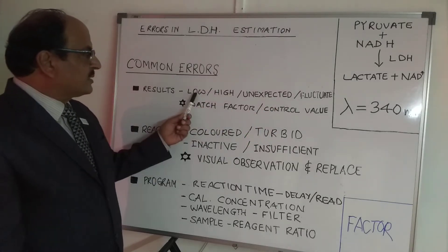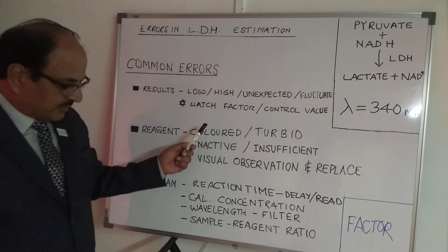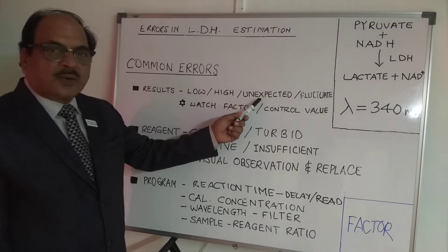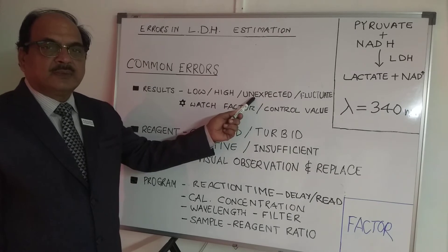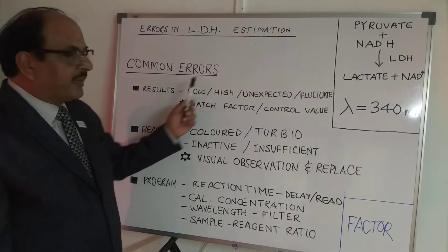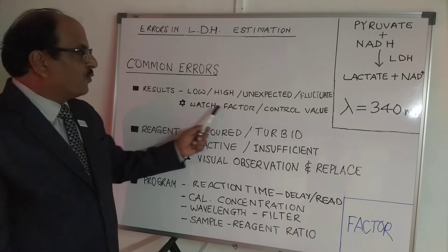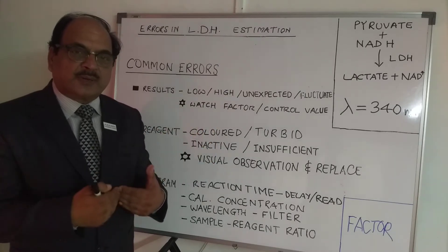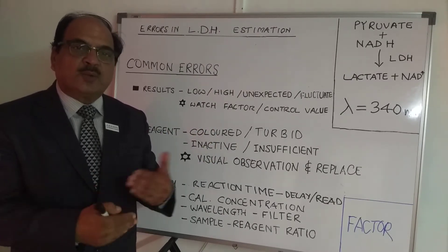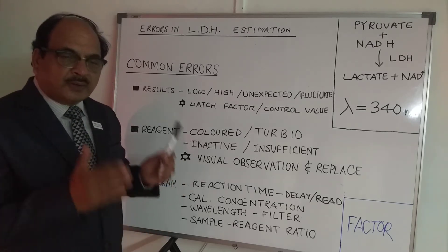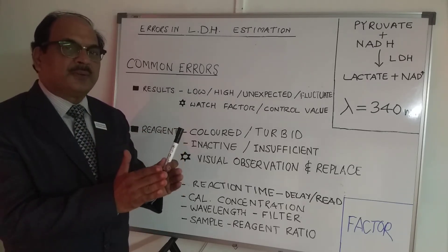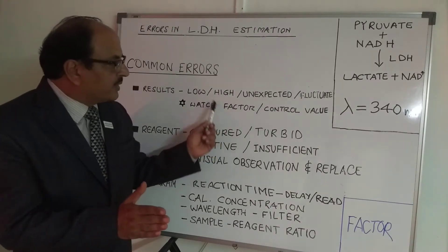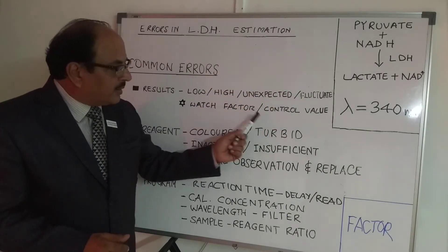Let's take them one by one. Result-oriented errors have four categories: low results, high results, results that are sometimes low and sometimes high, and results not as per the clinician's expectation. To address these, watch your factor. The factor is the concentration of the calibrator divided by the delta absorbance obtained when running the test. This factor should remain more or less constant day to day.